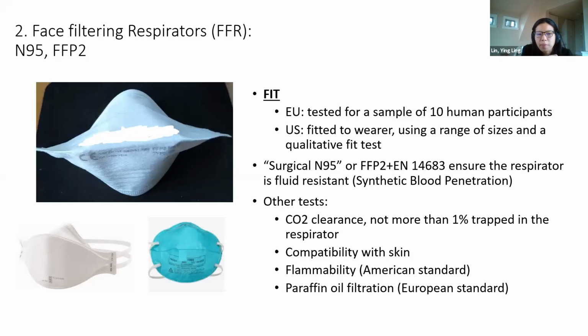So any of the air that's being breathed in is going through the material surface and not the sides, which are controlled for respirators. That's why you have to be a bit more careful with respirators and ensure that at least the fit is there. And that's really what guarantees a 95% filtration. So for medical face masks, because it's a loose fit, it's not really filtering everything. There's no guaranteed face seal. It's not tested for that. So even though you have 95% bacterial filtration of droplets, you may still have droplets coming in and out. So that's the main difference for a respirator.